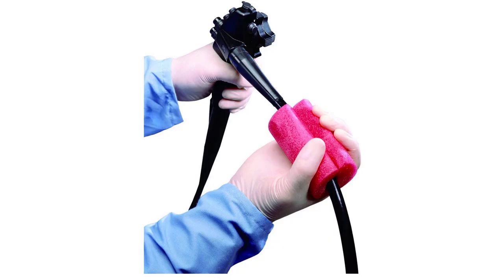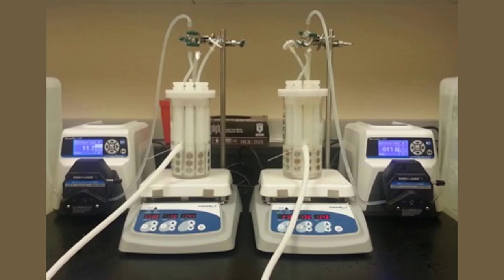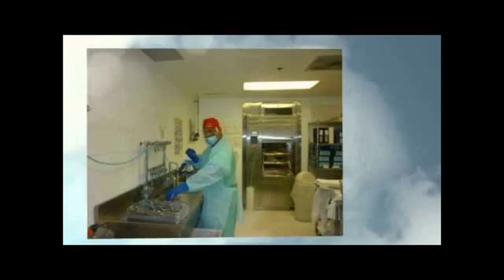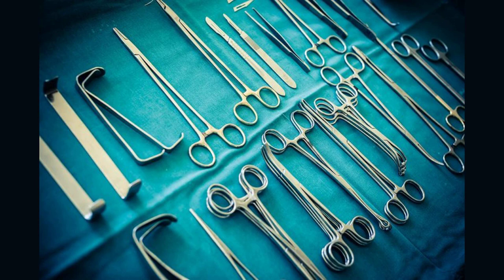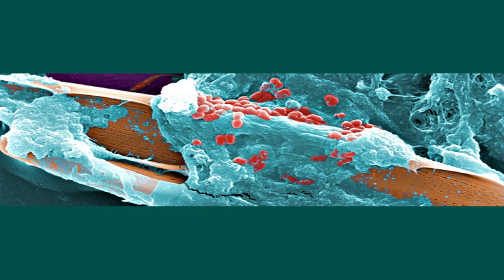While biofilm is visible in the later stages, it isn't always apparent at first. Since it can hide from view for a while, improper care could make the problem grow exponentially. Not all biofilms are created equally, they replicate and spread at different rates. Anything from fungi to bacteria could hide inside the EPS. However, all kinds are highly resistant to antibiotics and traditional treatments.